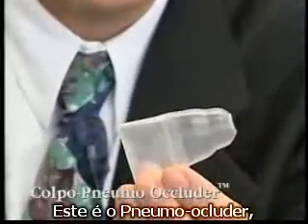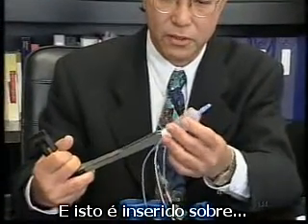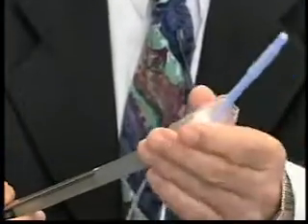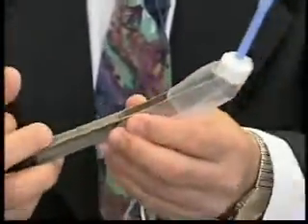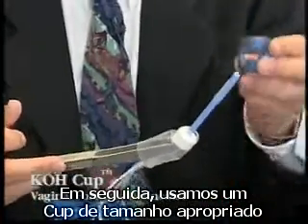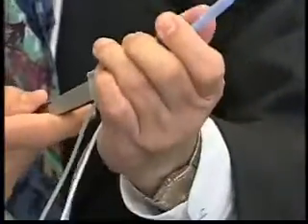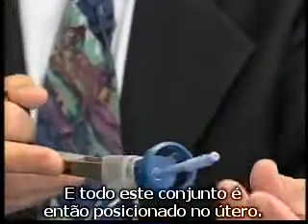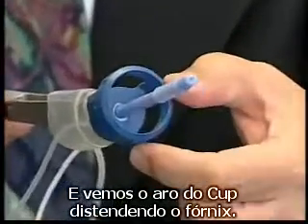This is the pneumooccluder, which occludes the vagina to prevent gas loss, and this is inserted over the tip. It does not hamper activity in any way. Next, we use an appropriate size cup and place it over the roomy uterine manipulator. This whole assembly is then positioned into the uterus and we find the rim of the cup distending the fornix.